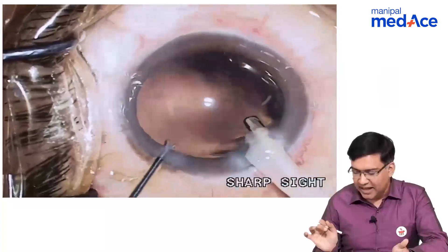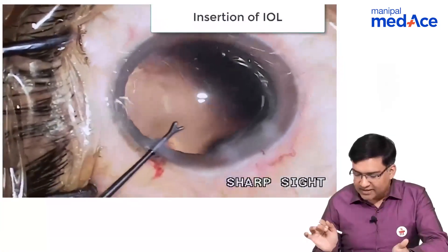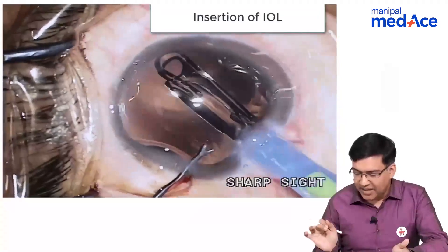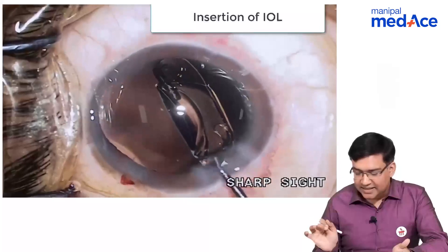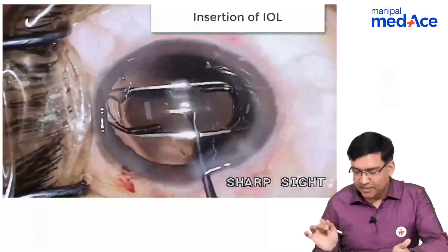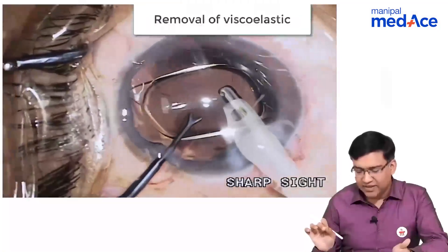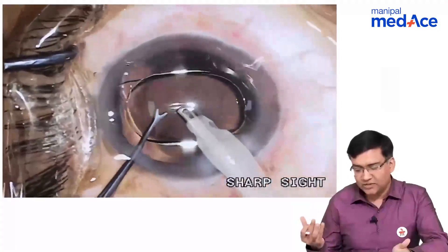It is absolutely clear and a retro illumination is coming through. Now, we are putting the intraocular lens. From the same 2.5 millimeter incision, we have put the intraocular lens — a unifocal intraocular lens — inside the bag, meaning between the anterior and the posterior capsule. Then, with the same irrigation aspiration probe, we are removing the viscoelastic.